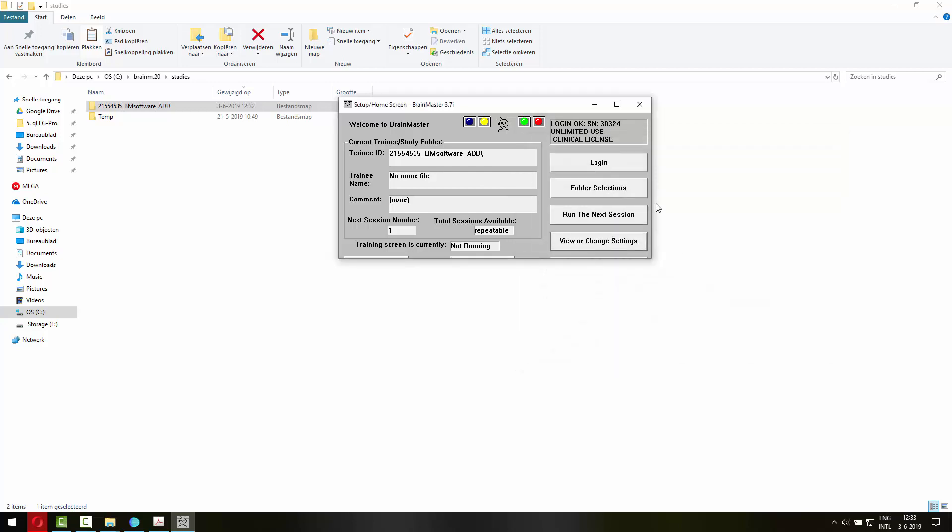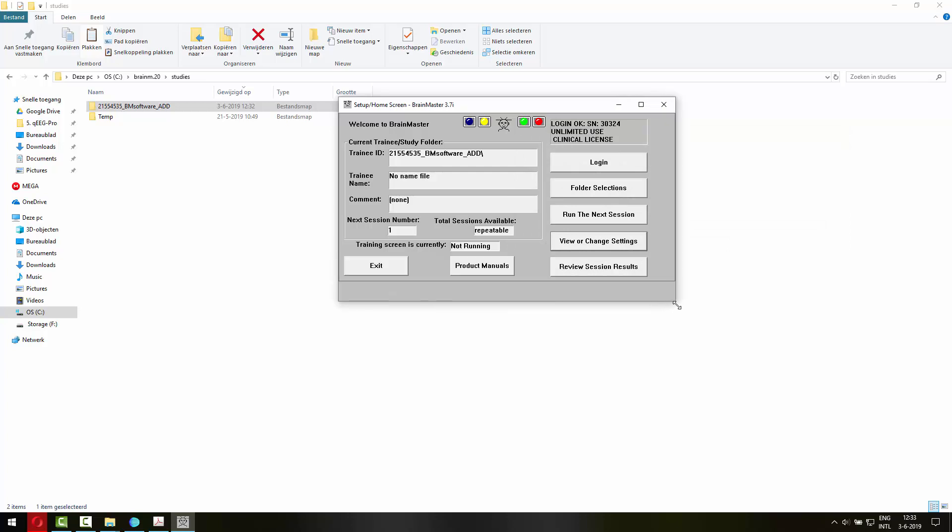You can also get protocol recommendations or settings file for the Brain Master software with two channels. And as you can see, more than one frequency.